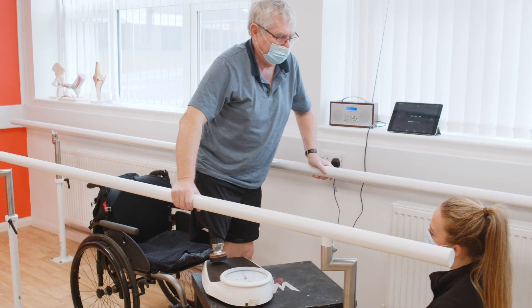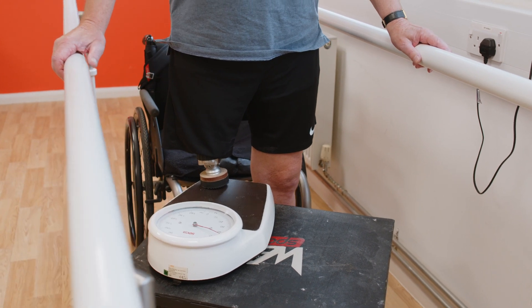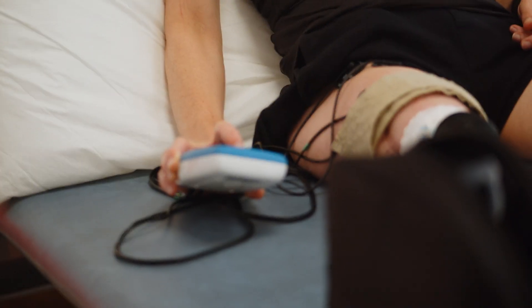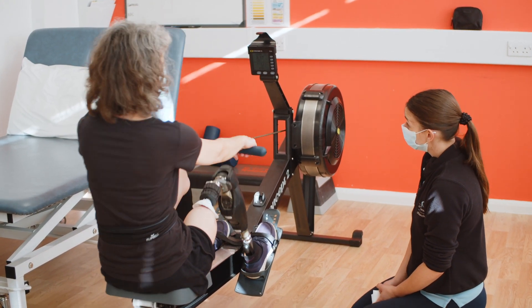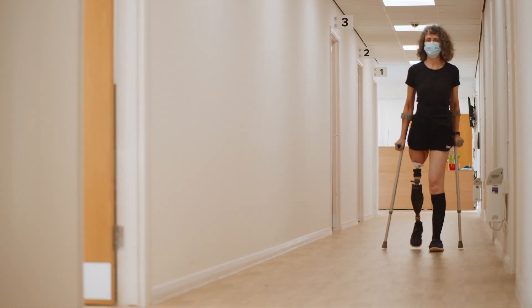It's actually been going really well. We don't actually know as a rehab team until post-surgery whether they'll be on the usual loading protocol or the slow loading protocol. It completely depends on their bone density and how the surgery went. So Catherine has gone on the slow loading protocol, which means it takes a little bit longer to get to the full weight bearing stage, but it's still the same process just over a longer period of time. This is the first week that we've been able to get the leg on and start the partial weight bearing phase of the osseo rehab.